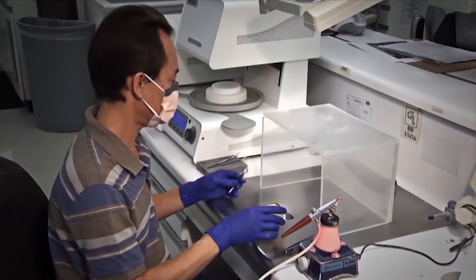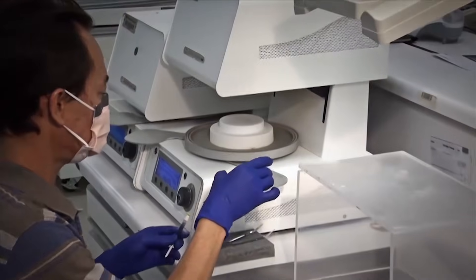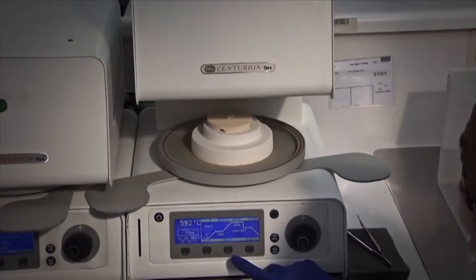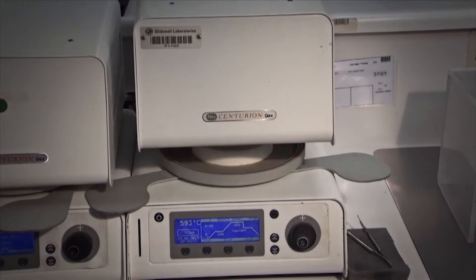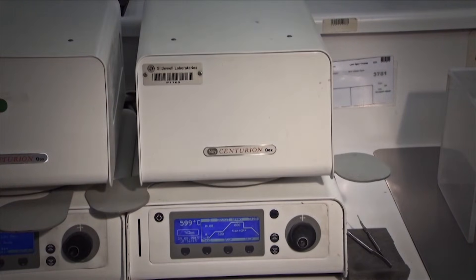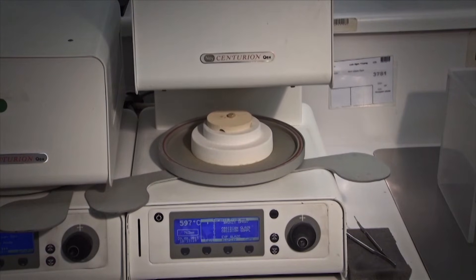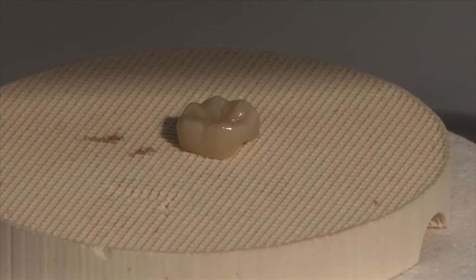Here we're spraying the glaze on. This is what Rella and Gordon Christensen aren't huge fans of, because that glaze we put on there, that makes it look pretty when it comes out of the oven. That glaze actually is rougher, has bigger particle size and is rougher than the zirconia oxide underneath it. And so really, the only reason that a Bruxer crown initially wears opposing enamel is because of that glaze on the outside.